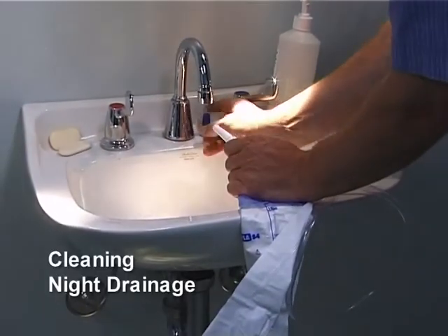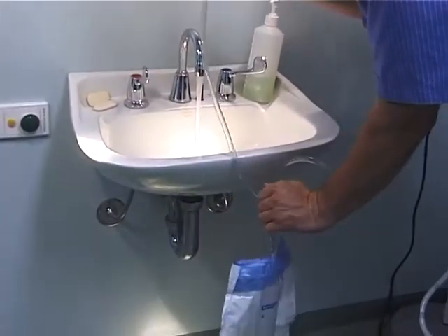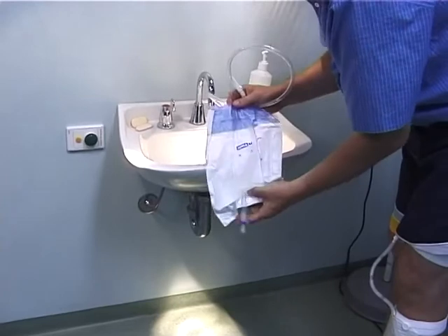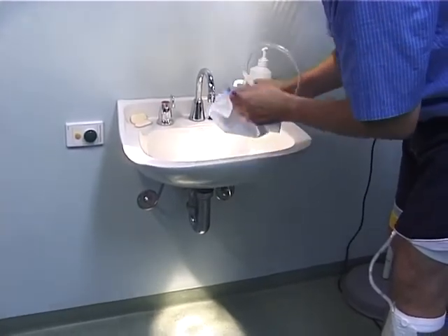Each day, the night drainage bag must be washed out. Firstly, a cold water rinse is required. Place the bag under running water and quarter fill the bag and shake the contents of the bag vigorously and empty out.